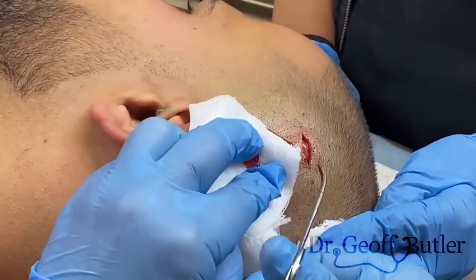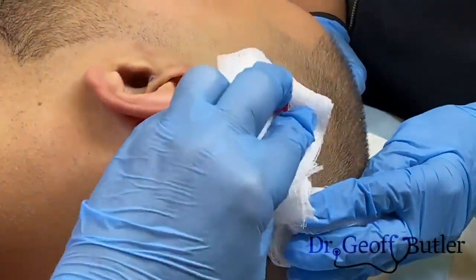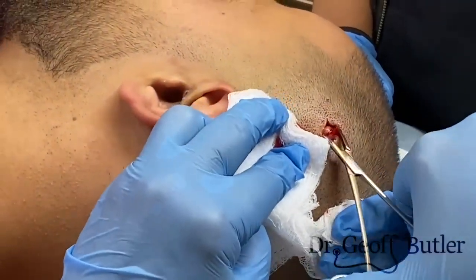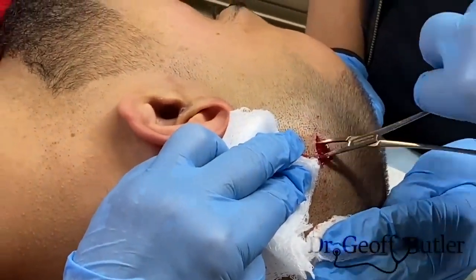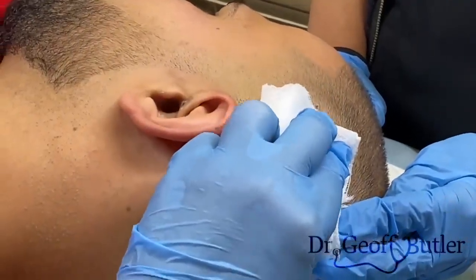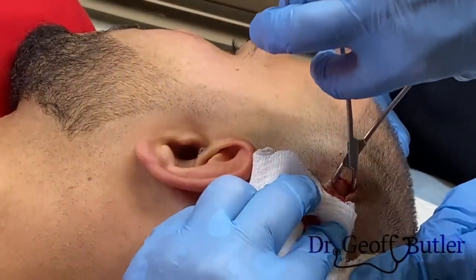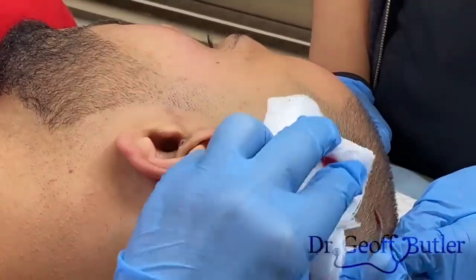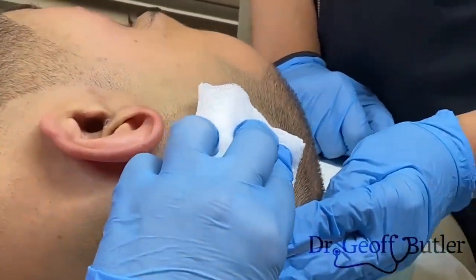Also, in terms of adhesions, how much it's stuck down in and of itself can sometimes give you some trouble. Not necessarily, but sometimes when you're trying to dissect it down and realize it's more problematic than you thought, it might be tethered in such a fashion you're like, wait a minute, what's going on with this? This has none of that. All I'm doing here is just trying to dissect it down enough. This may have some adhesions underneath it, which I'm running into now, but not from a problematic perspective. I'm just going to stand up a bit.